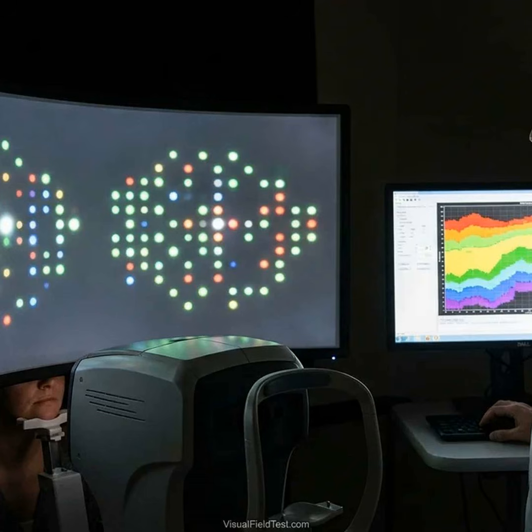Studies have found cases where red-green color vision declines were unexpectedly worse than achromatic losses. Temporal flicker perimetry targets the parasol M-cell system and has proven sensitive for incipient glaucoma, sometimes outperforming standard tests. Structural OCT and OCTA provide an anatomical map to match these functional findings. Regions of color-specific field loss tend to coincide with thinning of the corresponding retinal layers and with microvascular dropout.